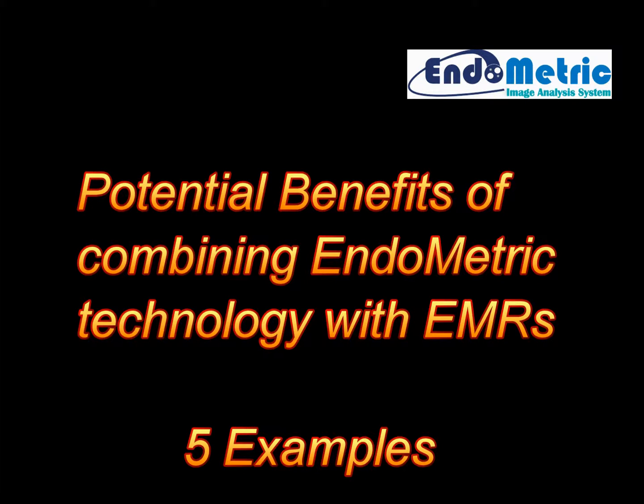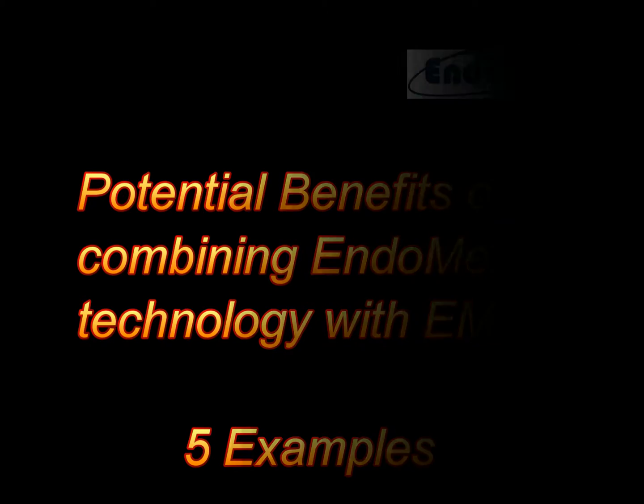Are there potential benefits of combining EndoMetric technology with electronic medical records? We believe there are, and in the next slides we'll give 5 examples.